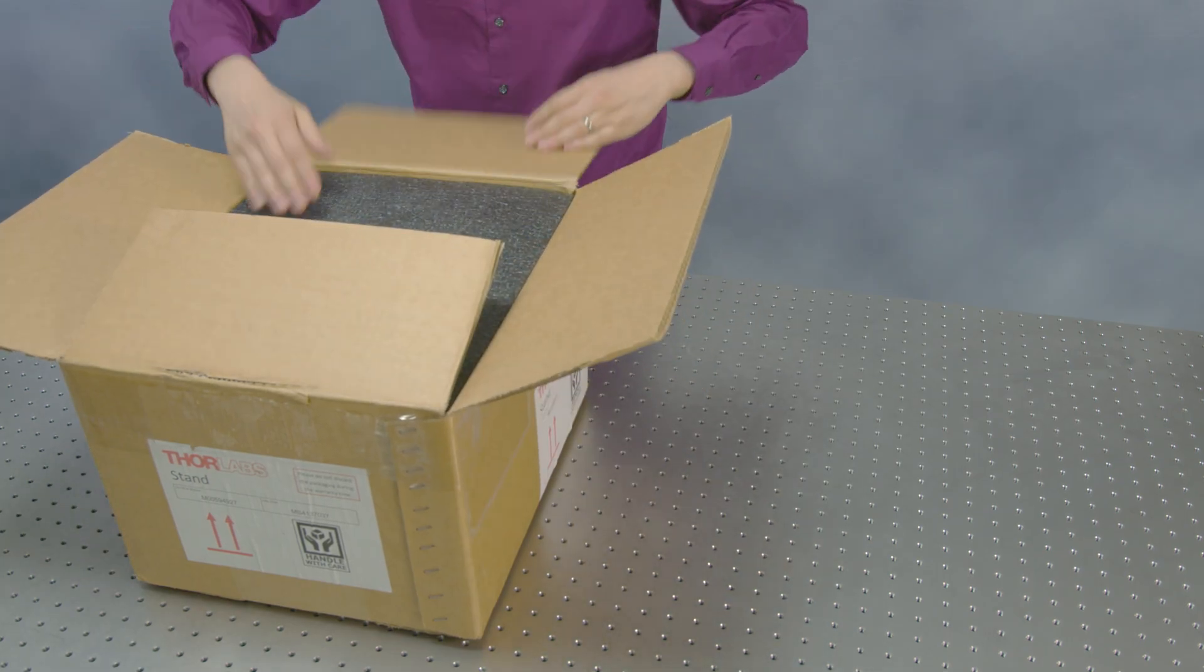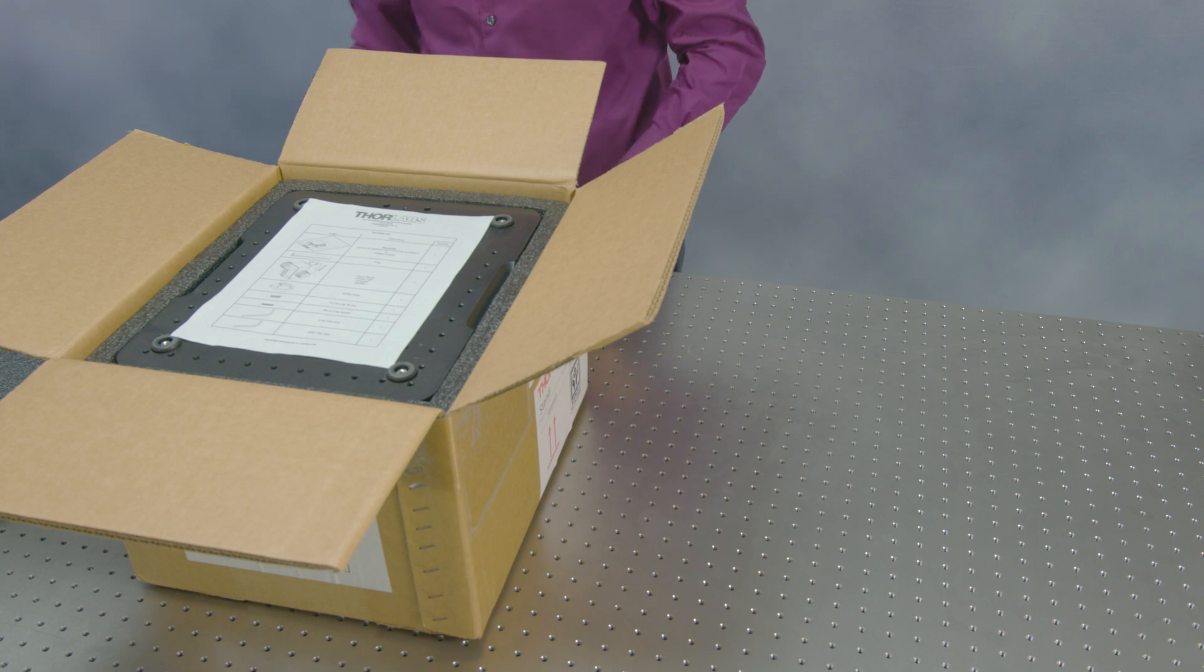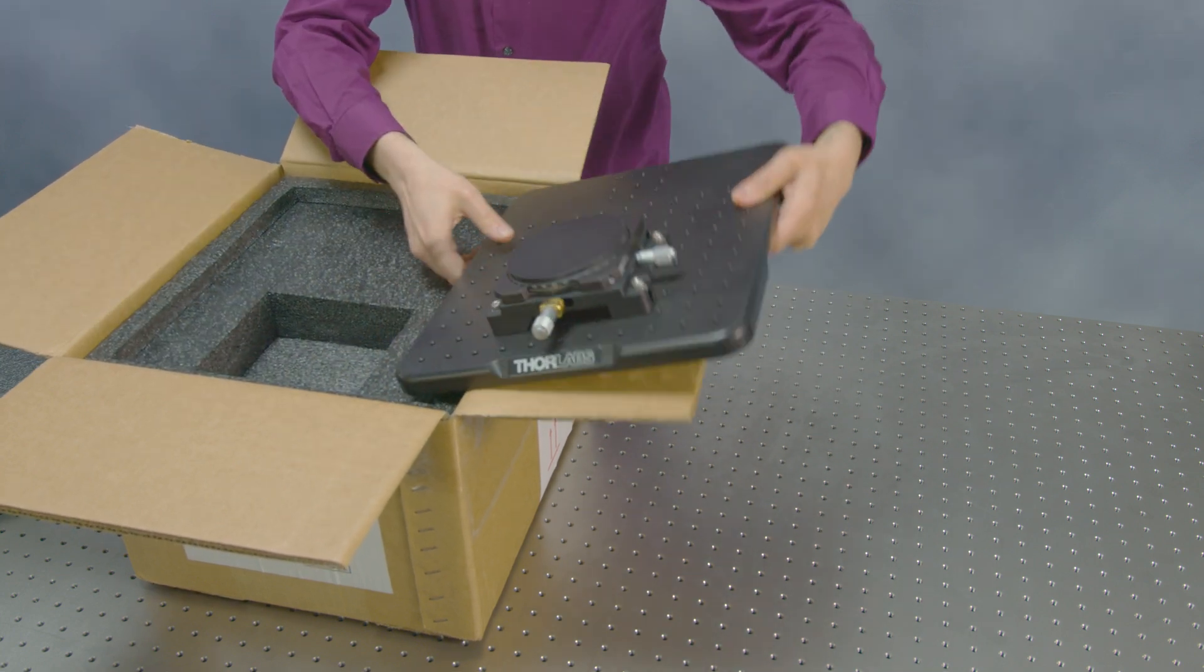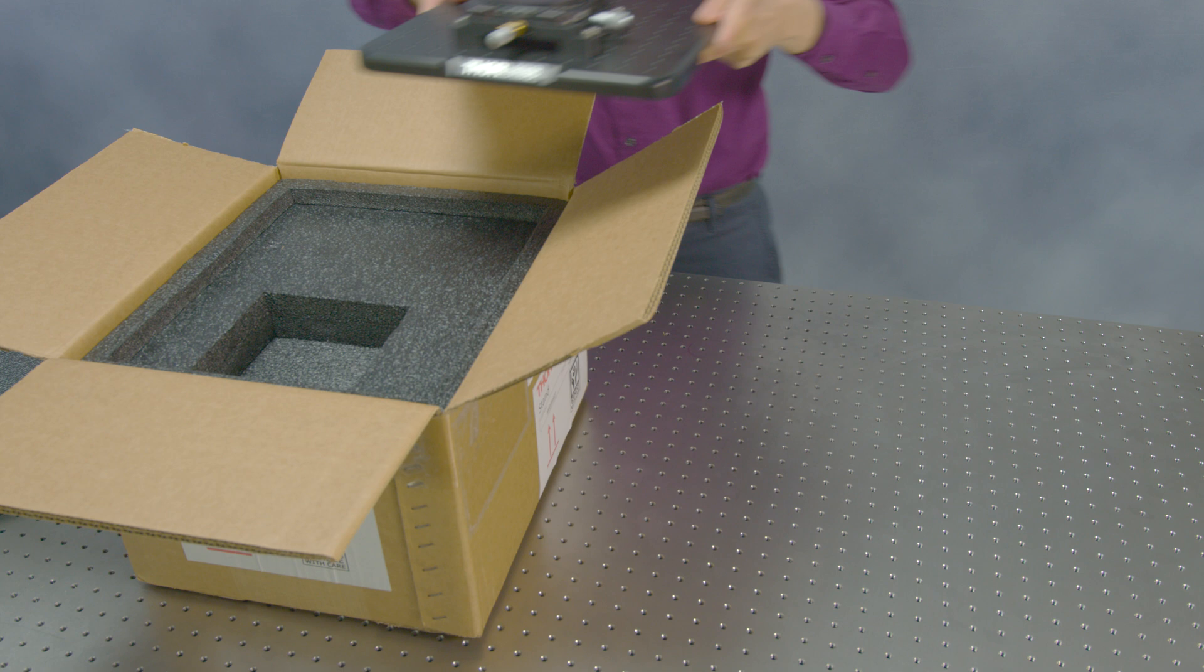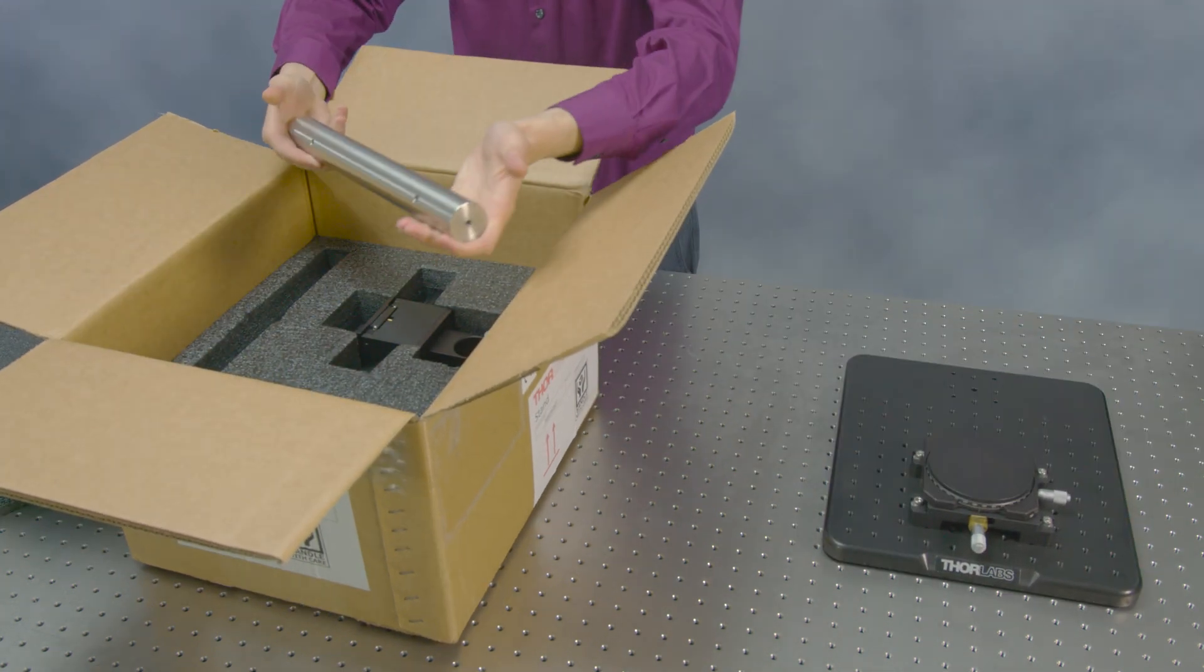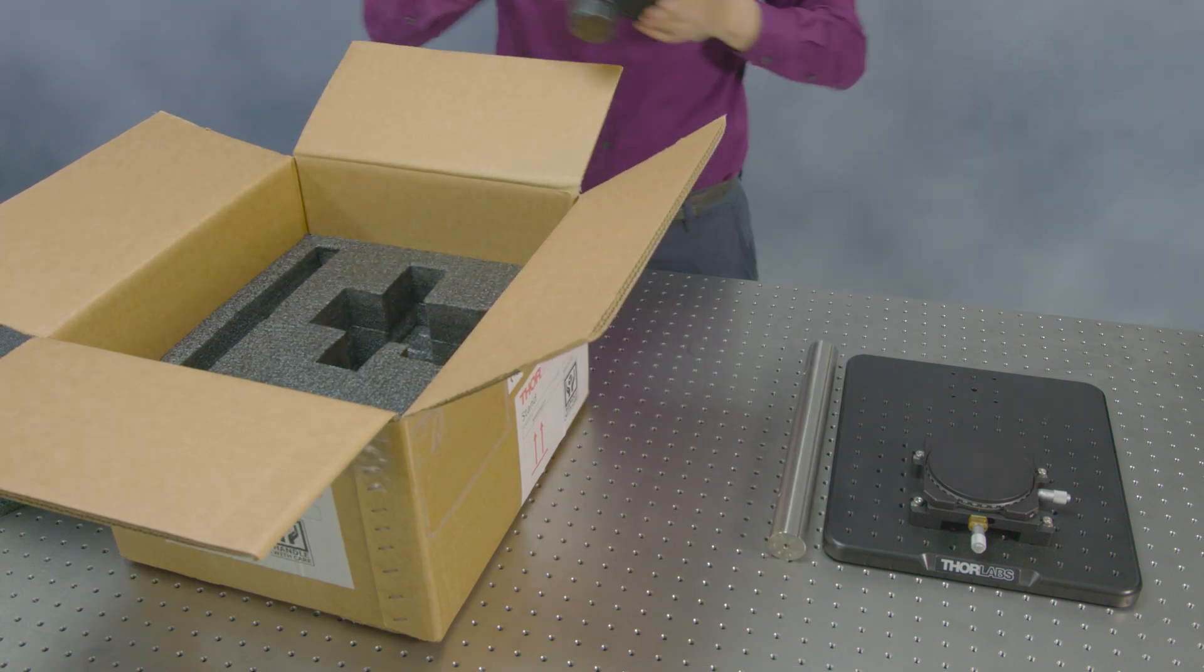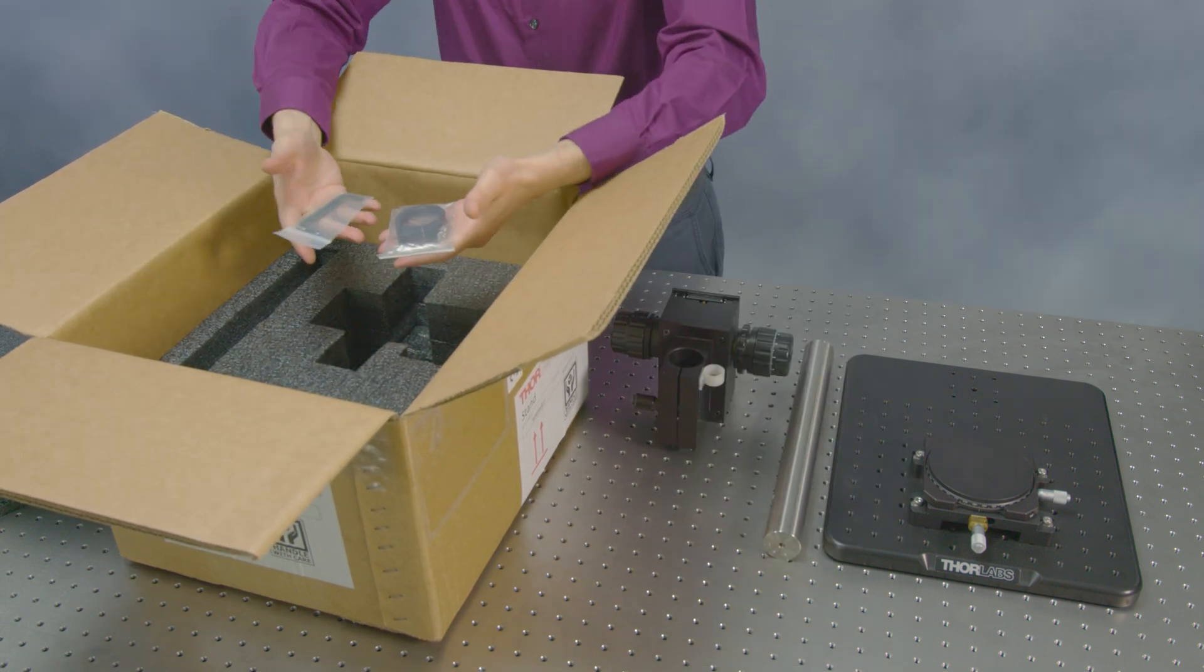Safely open the box labeled stand. Inside you will find detailed assembly instructions. Remove the breadboard with attached translation stage, optical post, focus block, safety ring, and hardware.